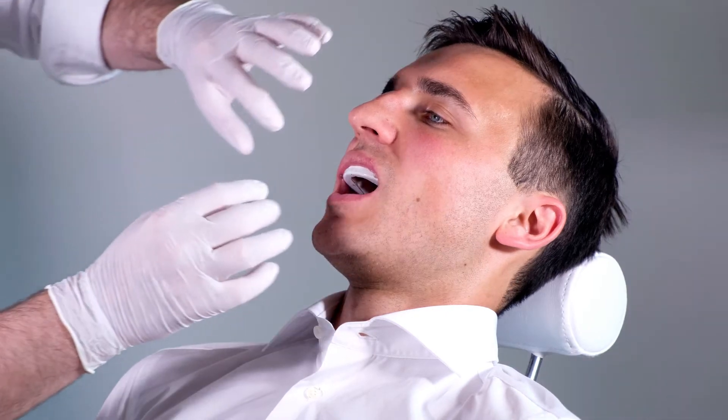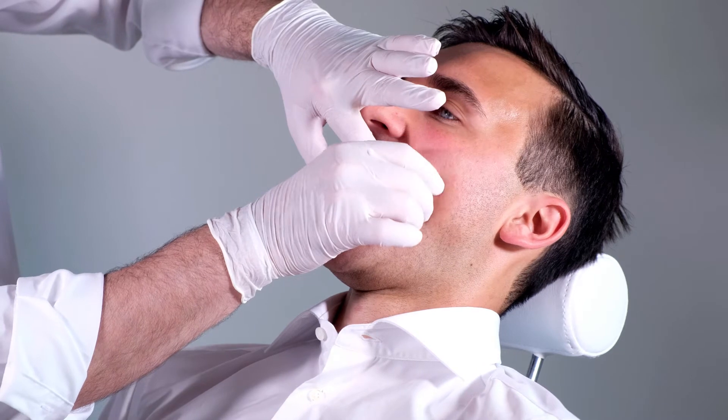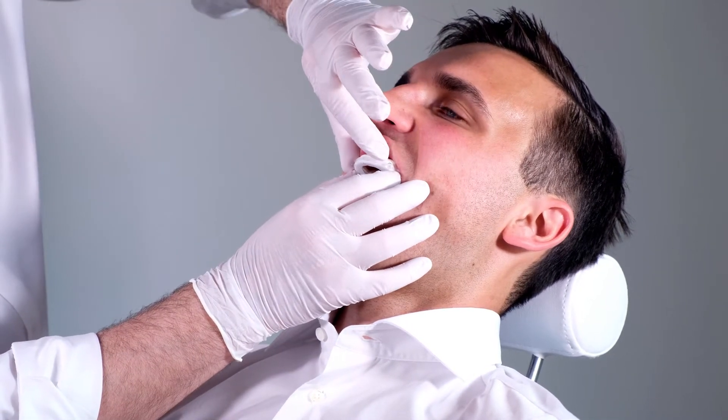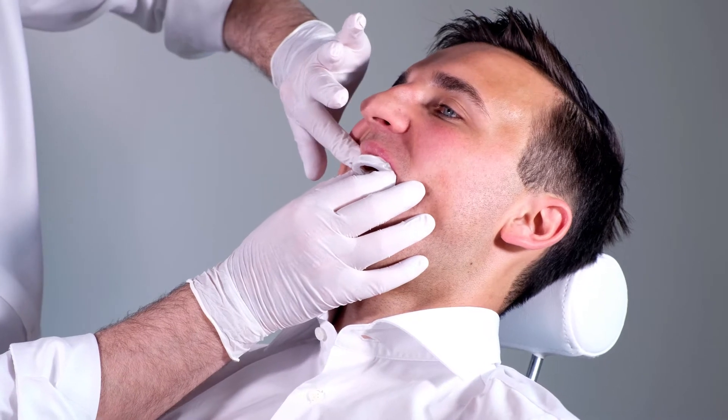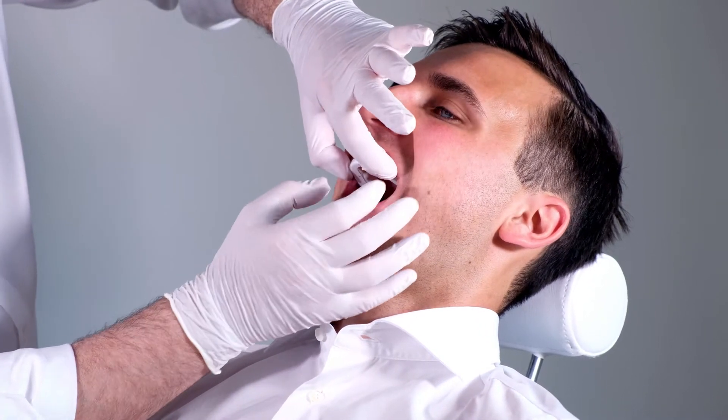With a slightly forward lower jaw, keep the mouth closed for about one and a half minutes. The patient should swallow and gently press the thermoplastic material with his or her tongue against the inner wall. Meanwhile, let the patient open his or her mouth and check whether the outer and inner wall of the tray are close to the teeth; correct if necessary.